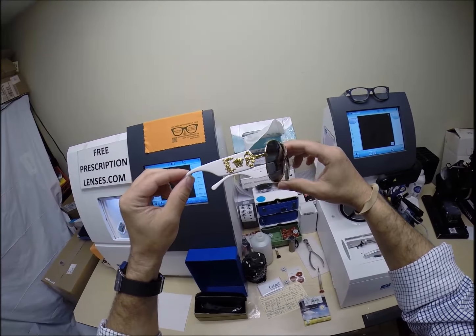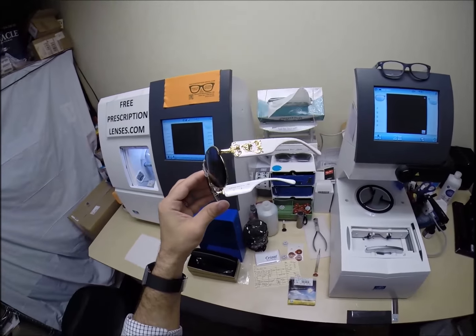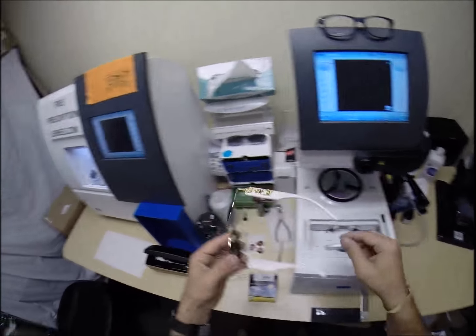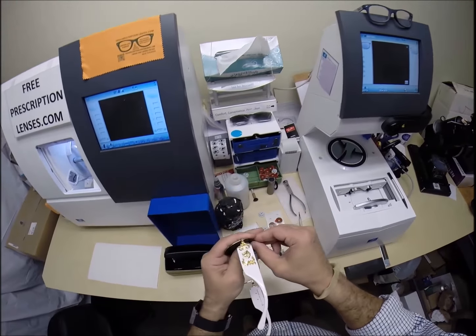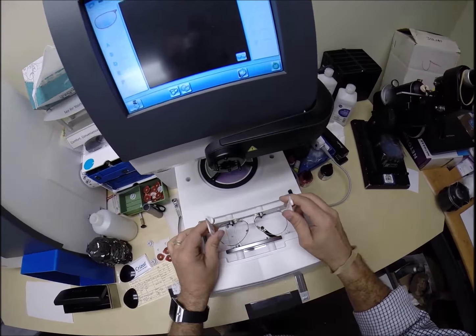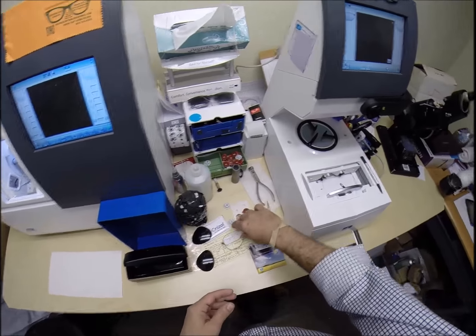This is tough. I love this frame. This is personally one of my favorite frames. So let me begin. And actually, because normally I would pop these lenses out, one of which has the Versace emblem on there, this one, and the matching serial number. Normally I would put this frame into the tracing element of my edger, but because this is very thin, it doesn't want to feel it.